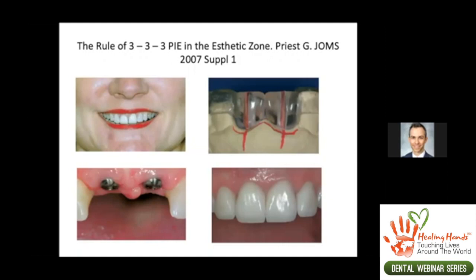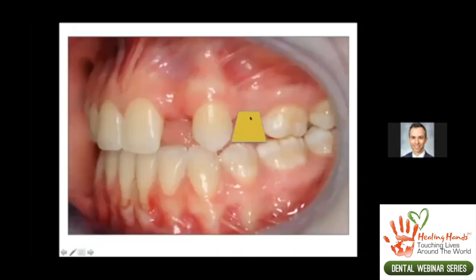And I like these types of surgical guides that are like a vacuum shell that just shows me the incisal aspect of the crown and where we want the center of the implant to be. Because this is a good guide, but it doesn't interfere too much with the implant placement.